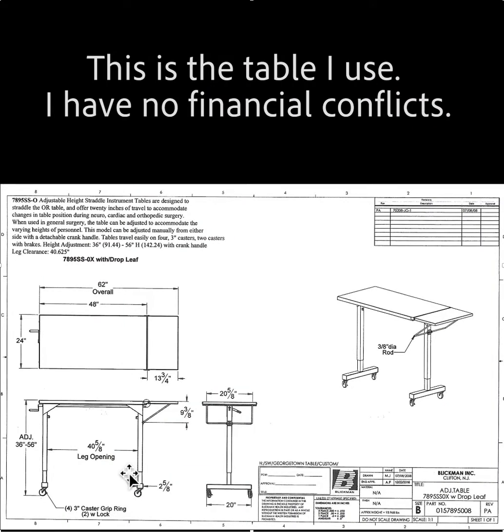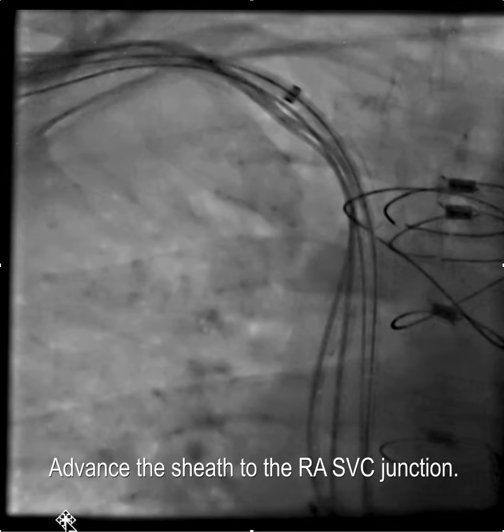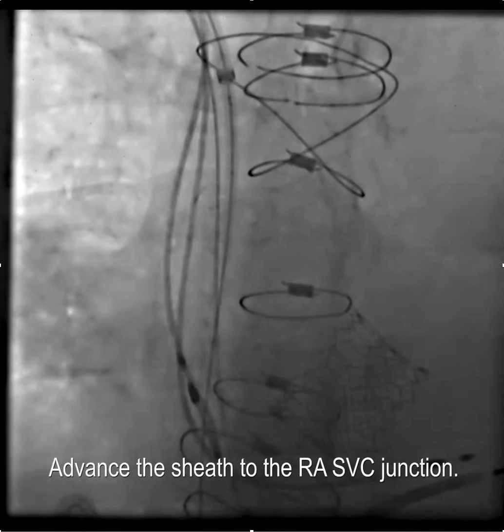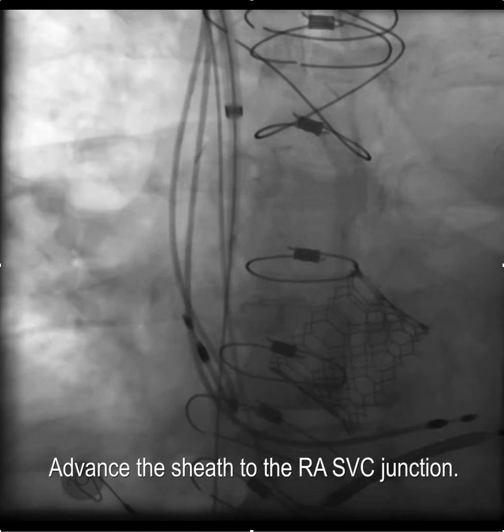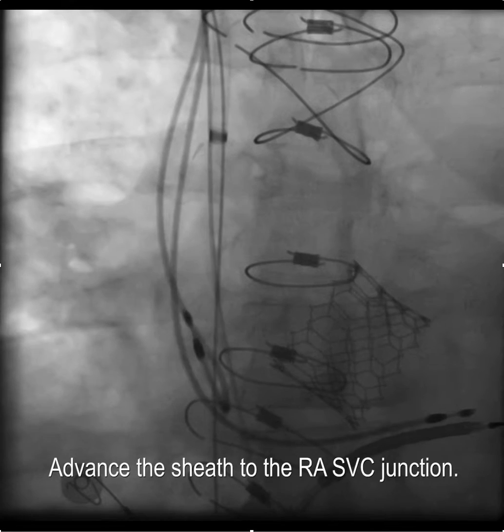This is the table I use. It has a flap on it so that you can go RAO and LAO without banging the legs. It also elevates to the same height as the patient. The first step is to get access and then advance the Whirly sheath to the RA-SVC junction, take out the dilator, and leave the sheath positioned right at the RA-SVC junction.